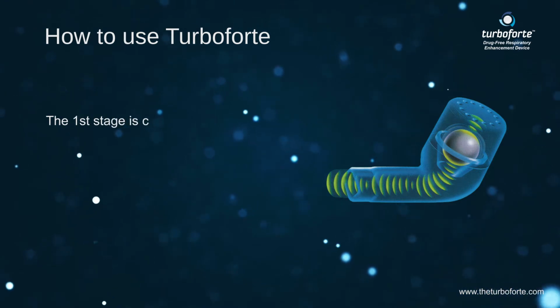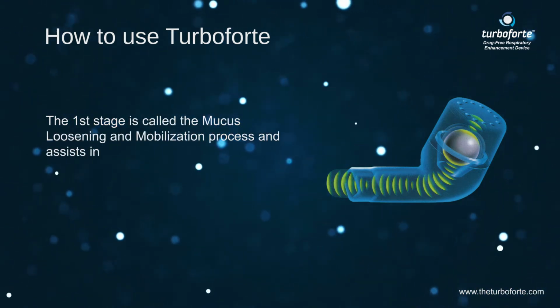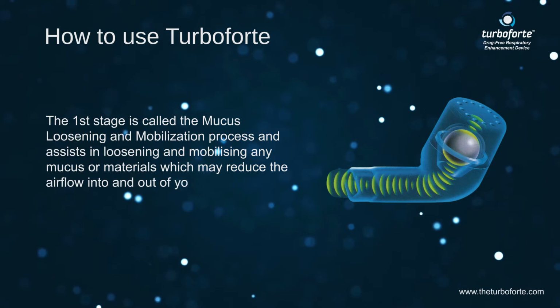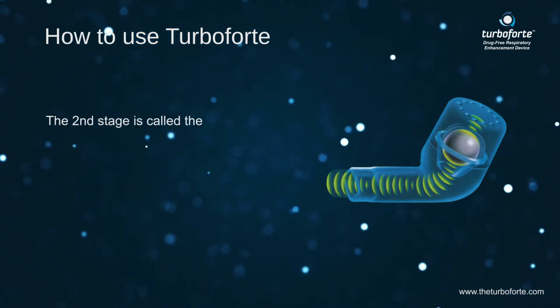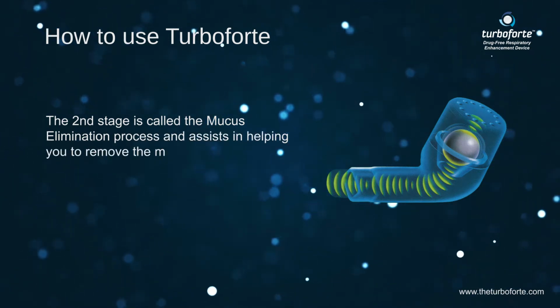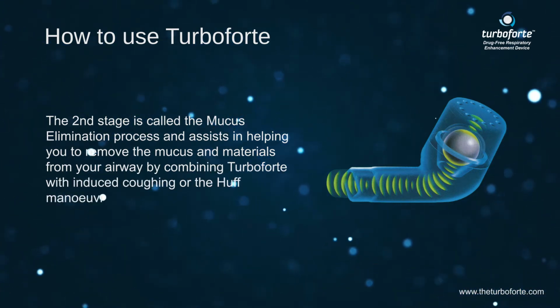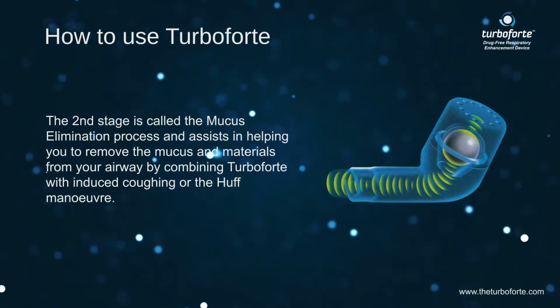The first stage is called the mucus loosening and mobilization process, and assists in loosening and mobilizing any mucus or materials which may reduce the airflow into and out of your lungs. The second stage is called the mucus elimination process, and assists in helping you to remove the mucus and materials from your airway by combining Turboforte with induced coughing or the huff maneuver.